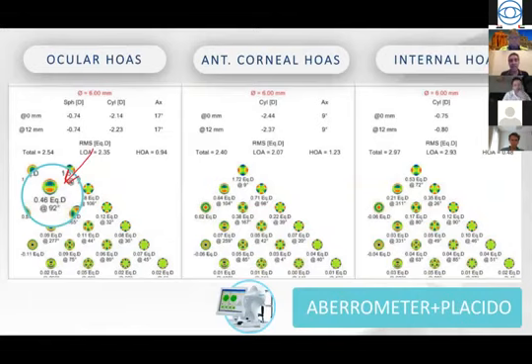So now, because we don't yet have the technology of total corneal customized treatment, I can do ocular. The patient luckily had big pupils, and I have a higher definition ocular aberrometer, so I treated ocular higher order aberration, because that would end up treating only the total sum of the anterior and the posterior curvature.